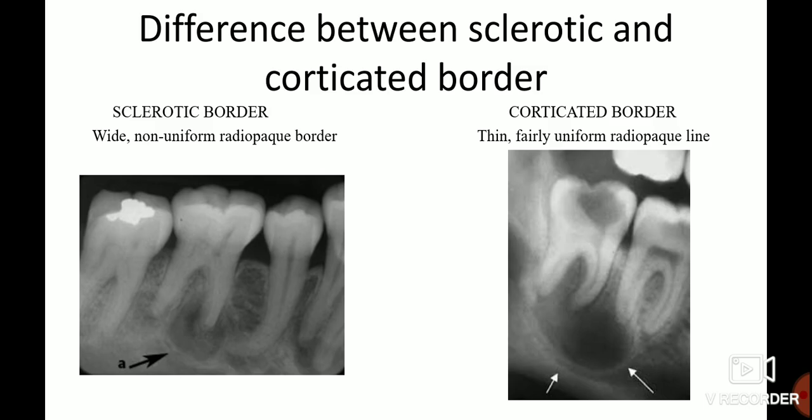Let's have a quick discussion about the borders surrounding the periapical lesion. A sclerotic border is a wide radiopaque border of reactive bone that is usually not uniform in width, whereas a corticated border is a thin, fairly uniform radiopaque line of reactive bone at the periphery of the lesion. If a lesion presents with loss of border, it is suggestive of an infected periapical lesion.